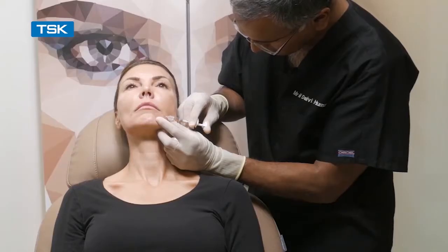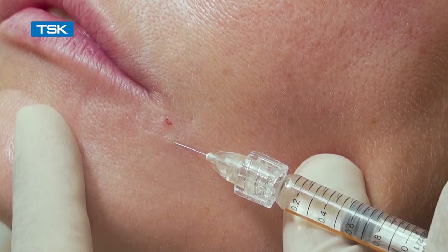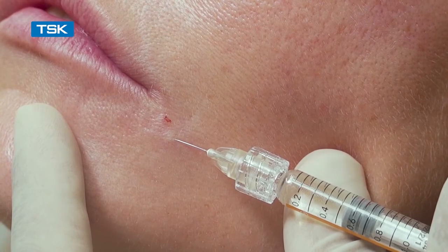The specific design of the hub stops the hub from popping off due to the high pressure. Here you can see the blanching occurring on the tissue.